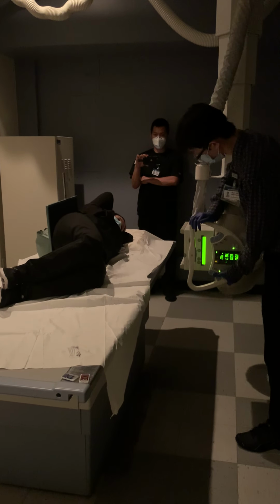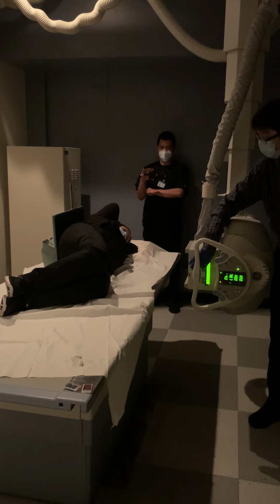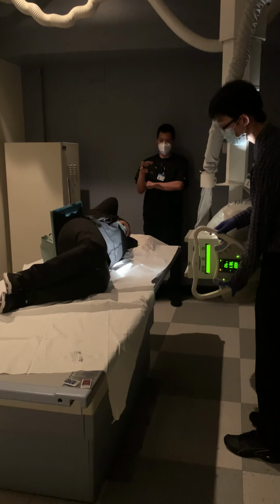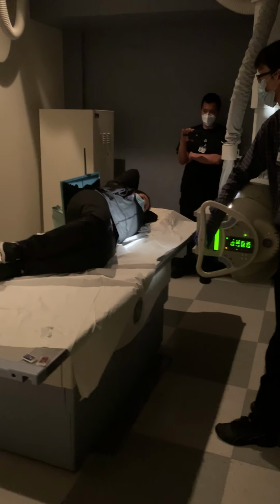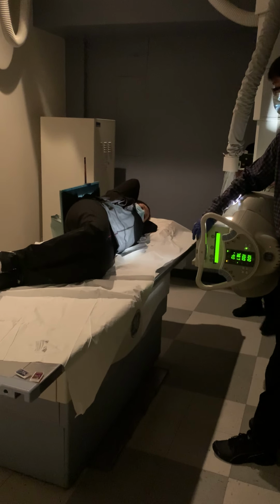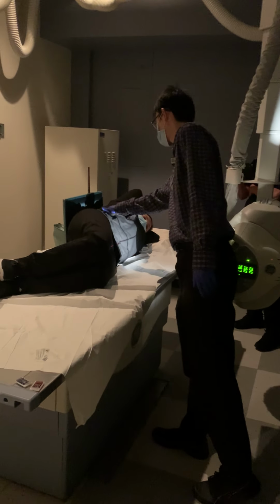I will finally bring this down to the MSP. Okay, MSP can be somewhere here between the legs. I'm going to collimate. Collimate sideways first, collimate vertical next. Just want to make sure we get the abdomen here.